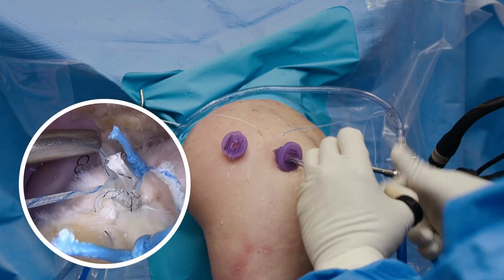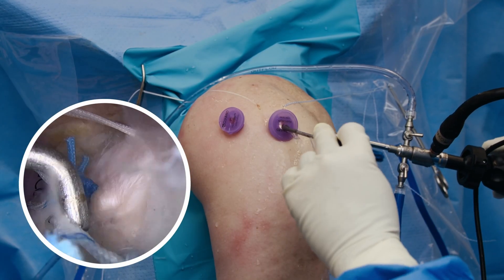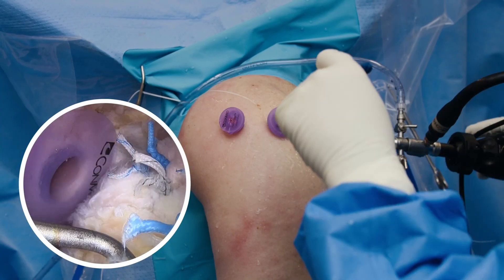I'm tying the last suture at this location, and I'm now using an arthroscopic probe to inspect the repair. I'm very satisfied with that primary rotator cuff repair.